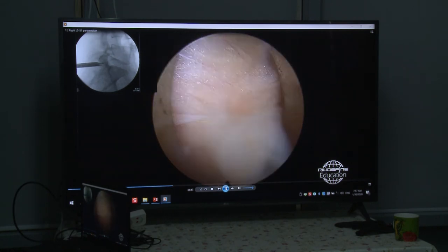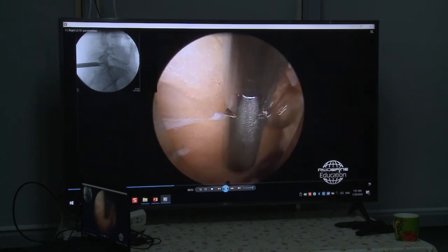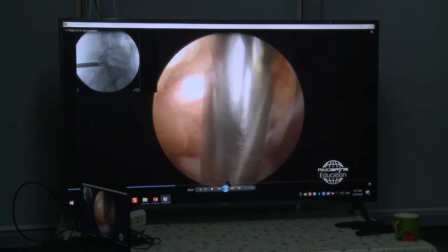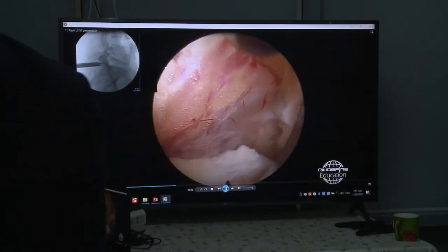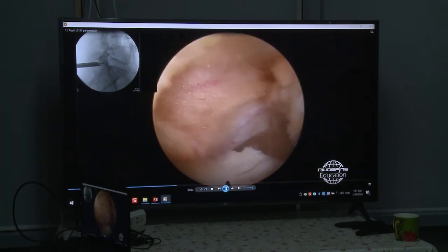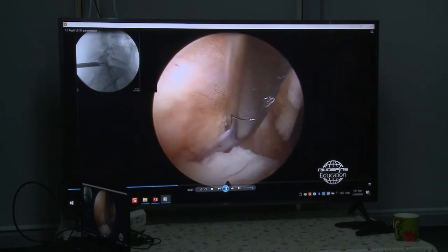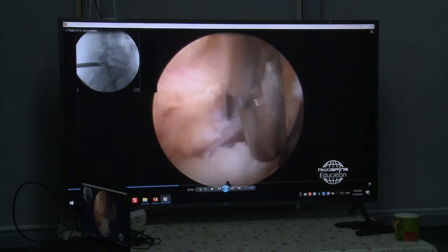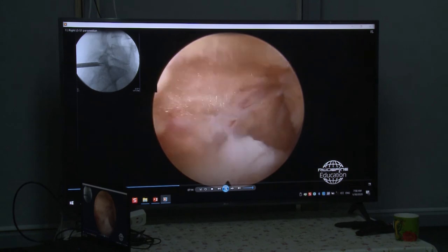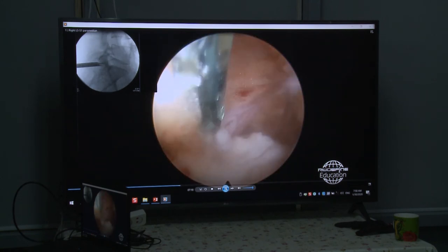preparing the neural structures. We do that all the time, yeah? I want to see the neural structures, definitely, and the recess. I think to identify exactly the lateral margin of the neural structures is an important step to avoid damaging.